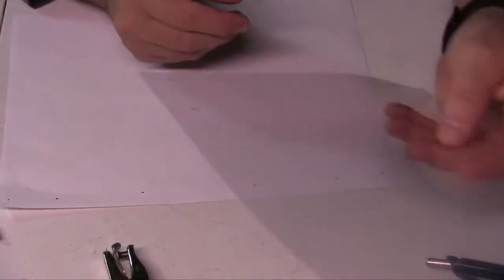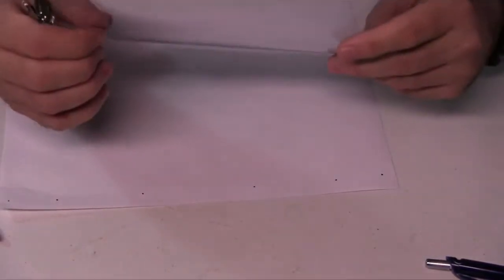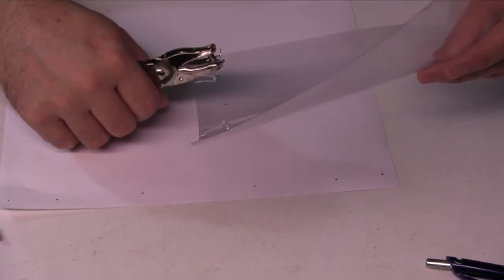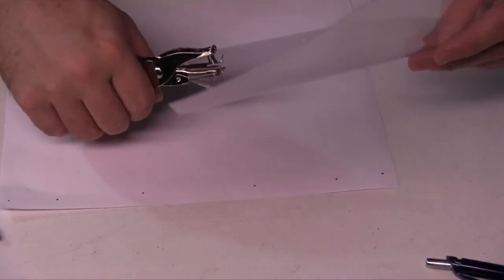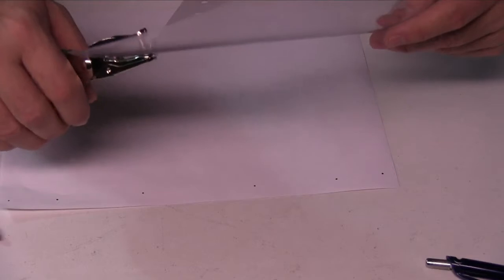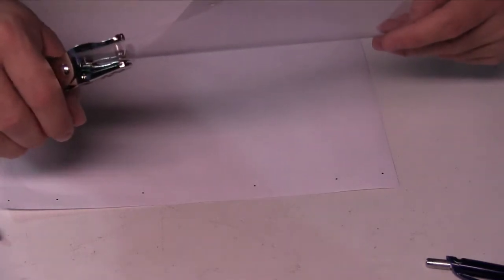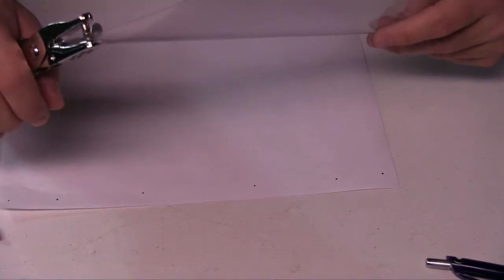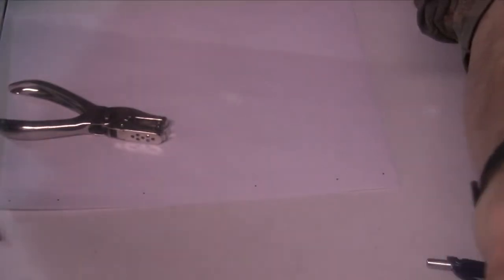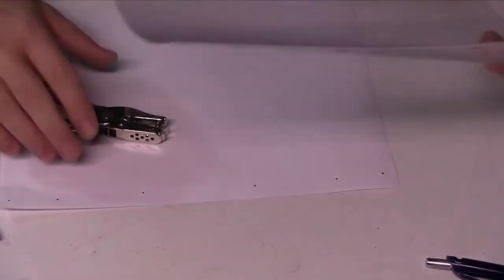So at this point, I'm going to take this plastic sheet, and I'm going to use my 3-hole punch. Now this is pretty rugged material here. This is very thick plastic here. So we'll see how well these holes come about here. And line them right up in the middle of that, and there, and there, and there. That one's a little off. That was actually more difficult to do than I thought. So now you'll see that my plastic sheet has holes in it, little holes. I hope this worked out well. Maybe there's some trial and error.